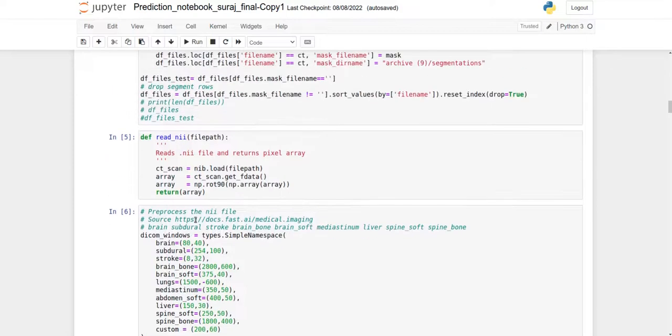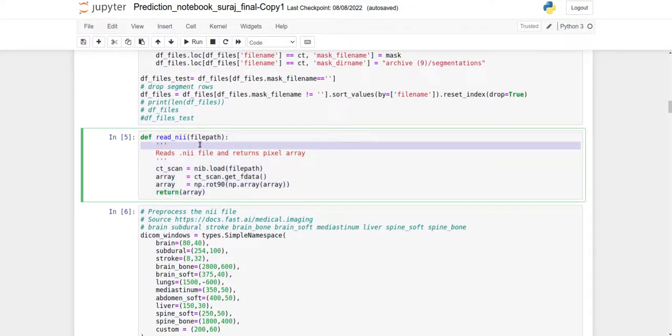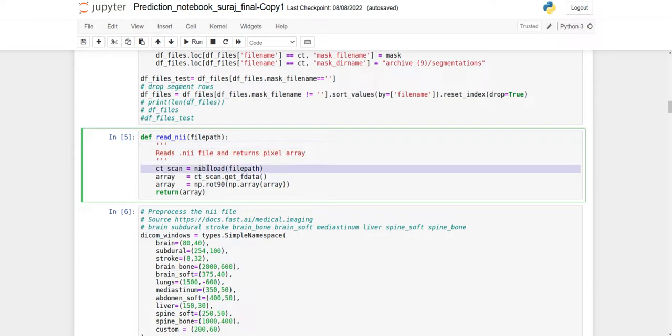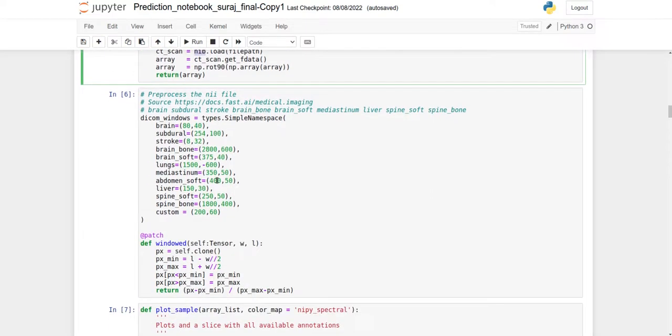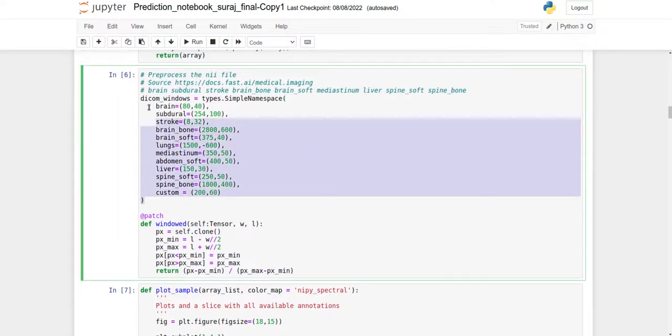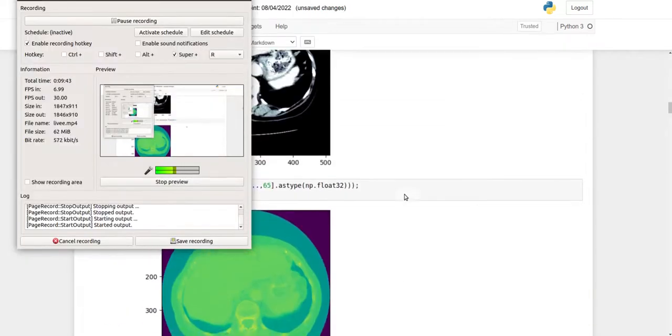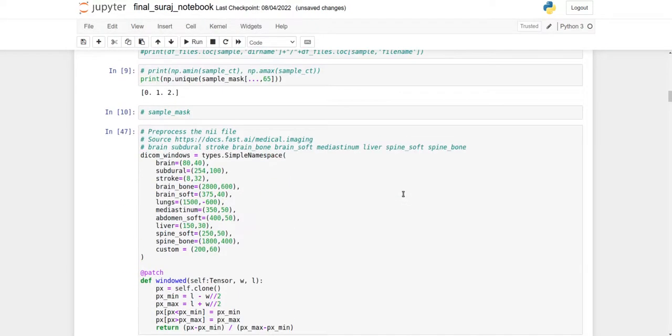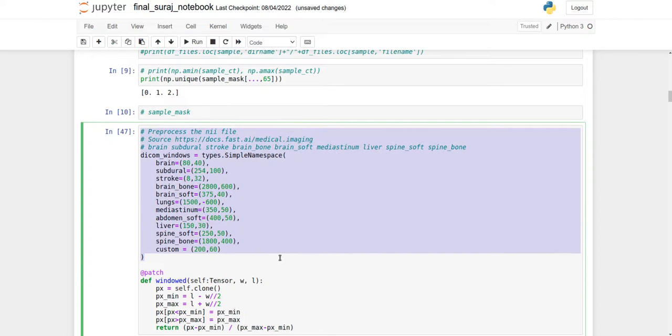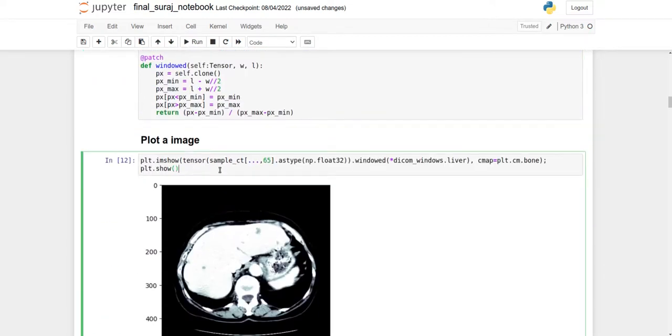In this dataframe, you can see the directory name and file name. Now we arrange the files: files with segmentation extension go to the target file name, and the rest are input files. This function reads the NIfTI file format using NiBabel.